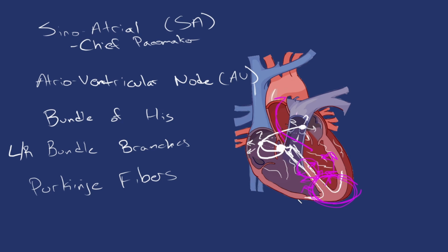Each part of this is what we're going to wind up drawing out when we get to the actual 12 lead interpretation part. So as long as you understand this, good. If you need to come back and rewatch this, or go find Khan Academy, which has great videos on it. From there, the next part is understanding what the EKG even is.